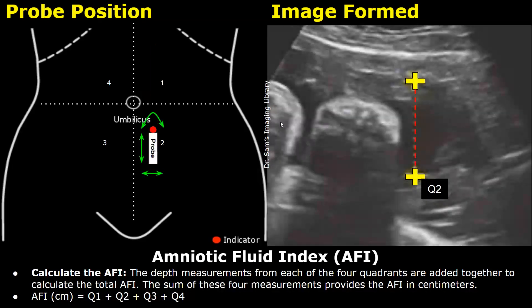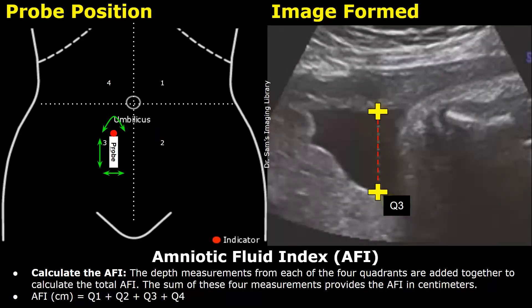Then move to the second quadrant, which is the left lower quadrant. After finding the required amniotic fluid pocket, you can take the measurement in quadrant two. We have now taken two measurements.